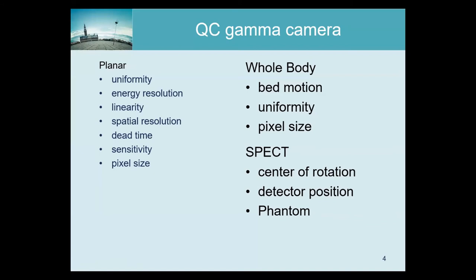And these bed motors are these days very good. So they are stepper motors and they typically have a feedback mechanism. So they tell the bed to move to that position and then it is verified with an independent measurement if the bed is really there. So the chances that this could go wrong are pretty small these days, but it still could go wrong. So it's still a good idea to check. In particular, if you buy a new system, they all come with new weaknesses and strengths. And so it's a good idea to get to know your system. And if you discover that this is a weakness of the system, you have to measure it more often.